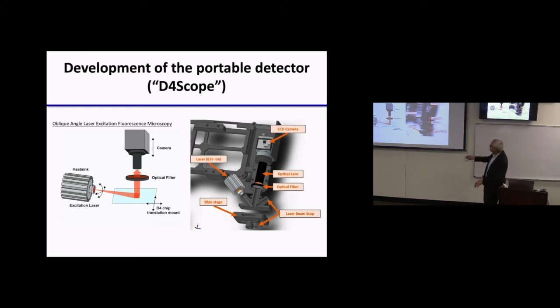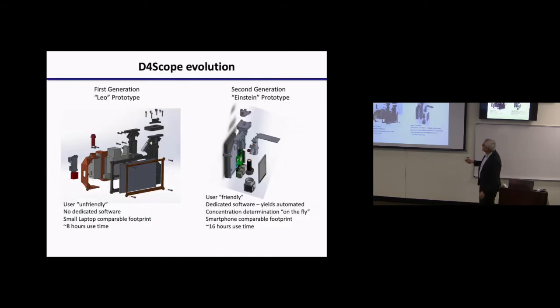So this is what the parts look like. This is the chassis that it's assembled on. So all the chassis is 3D printed. He just snaps it in place and then puts a nice box around it. More details that you need.